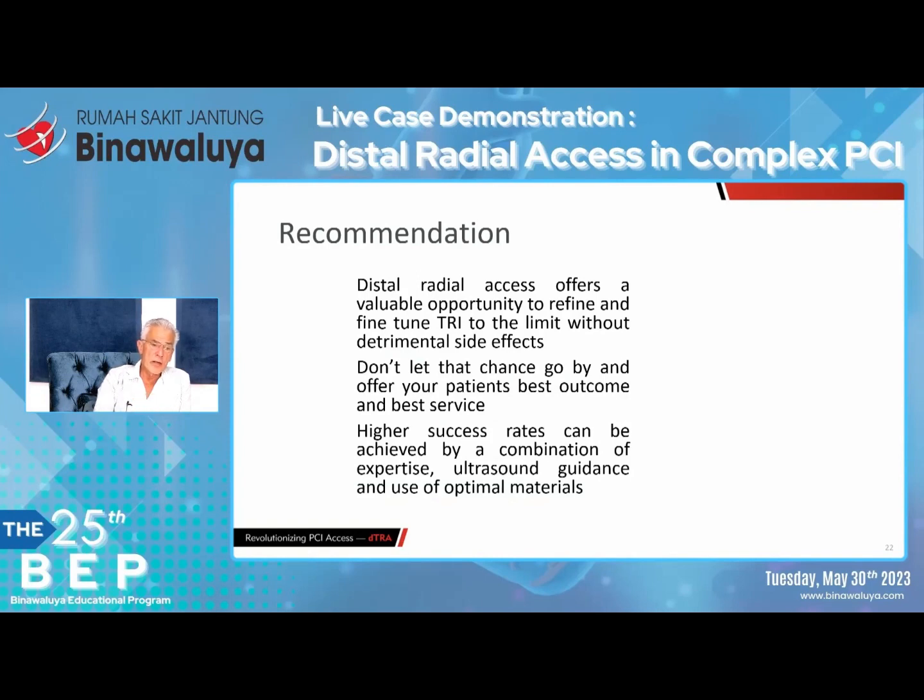You can increase your success rate by becoming proficient, do this on a routine basis, use the proper tools, use ultrasound guidance, especially early in your learning curve, and you will see that in the long run, you will become just as proficient as with conventional radial. Thank you very much for listening.